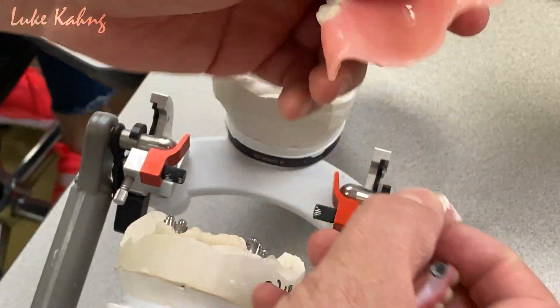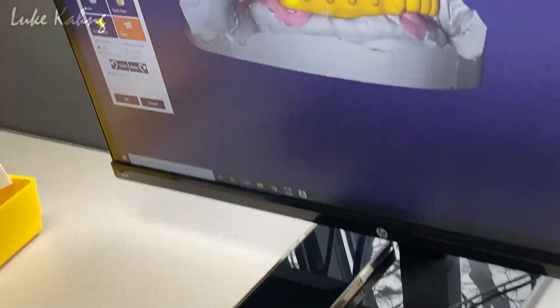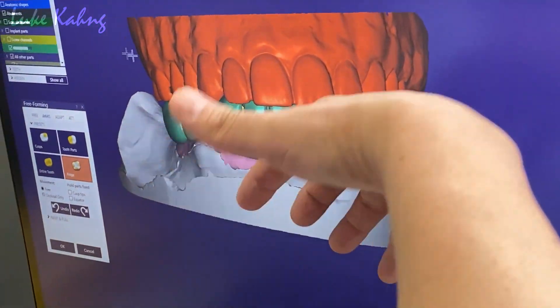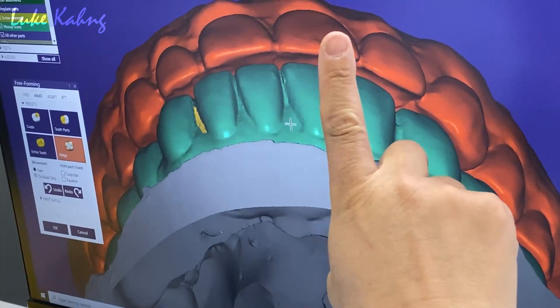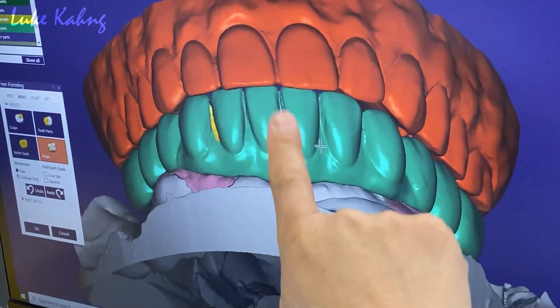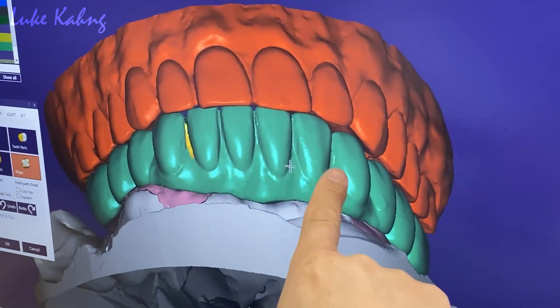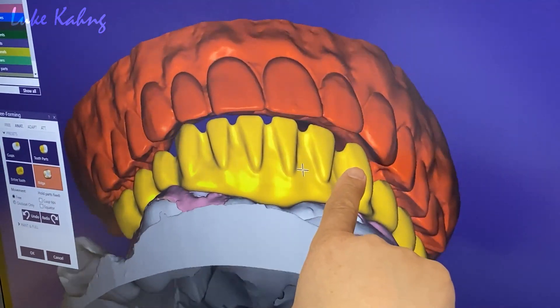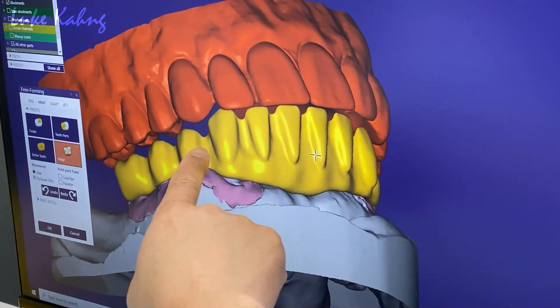So what we're going to do with the computer here — we set up and show the final work. Show me the occlusion. We're trying to get the occlusion contact first. Number two, we're trying to cut back all the way down, 1.2mm. I'm trying to get the canine rise from canine to canine.